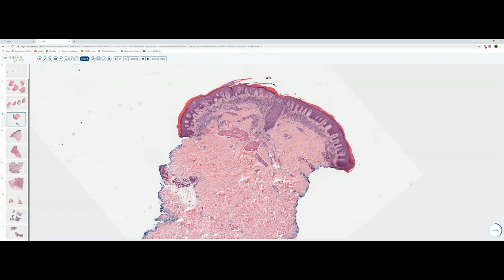The epidermis is hyperplastic, and there's kind of a dense band-like infiltrate, which appears largely lymphocytic and which is focally obscuring the dermal epidermal junction. And generally, when you see a psoriasiform lichenoid dermatitis or infiltrate, three things should come to mind in the differential right away: secondary syphilis, lichen striatus, and mycosis fungoides.